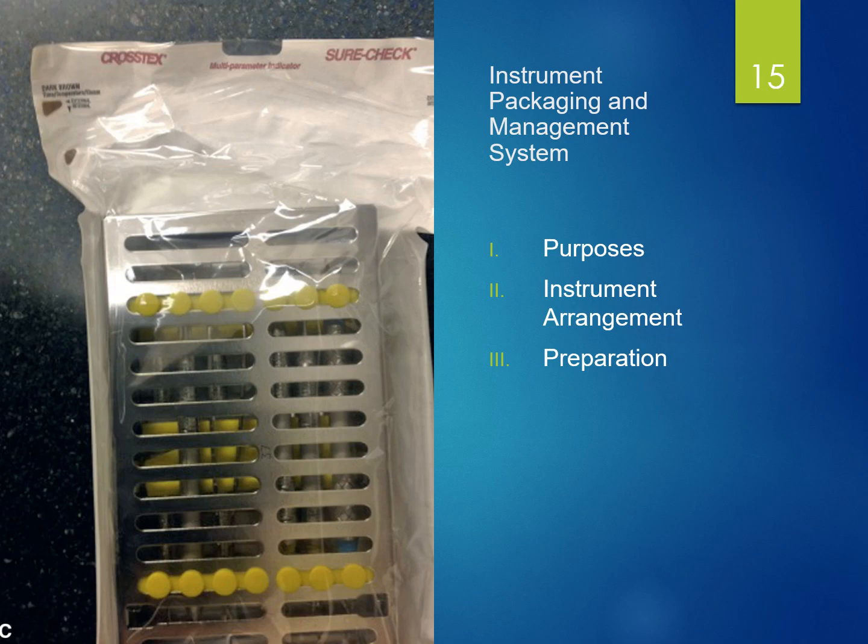And then each package is dated. And then also for the mark for content identification, such as prophylaxis, examination. The clear packages are much easier to see through, and so you don't often have to use special labeling of what the kit is. They can be organized into trays for your initial exam, adult patients. So it just depends on your type of packaging.